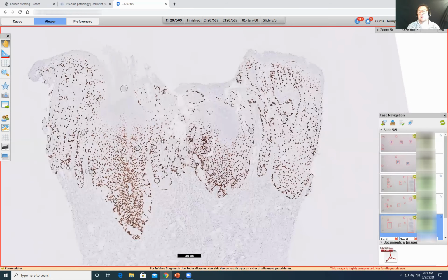So, and the one utility it has, and the reason I'm pointing it out, is adenocarcinoma that's metastatic to the skin is negative by and large. And so adenocarcinoma, whether it's an adnexal carcinoma or this, that's primary to the skin will be positive. So it's actually useful, but it's only useful for adenocarcinoma. It's not useful for squamous because it will hit squamous cell carcinoma.